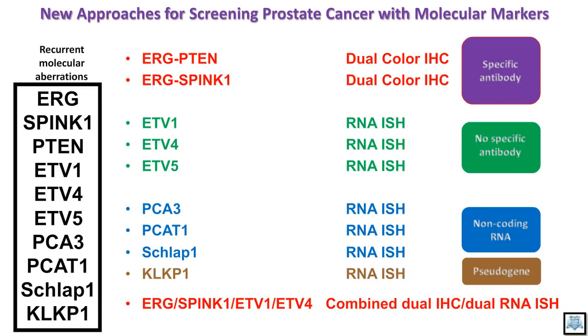Having developed both IHC and RNA-ISH, we were interested in studying these markers in a multiplex mode rather than studying each marker individually, which would be time-consuming, laborious, and sometimes limited by the availability of tissue specimens. For those reasons, we are trying to develop a multiplex method where we can detect more than one marker in a single experiment.